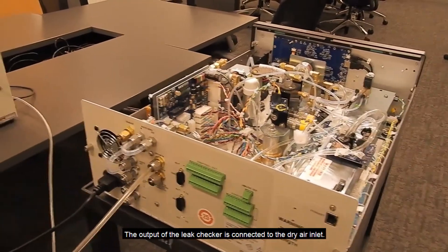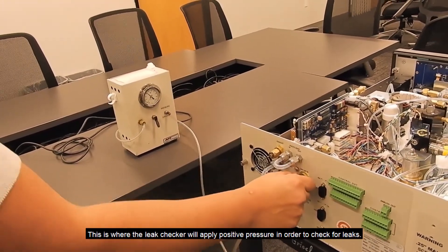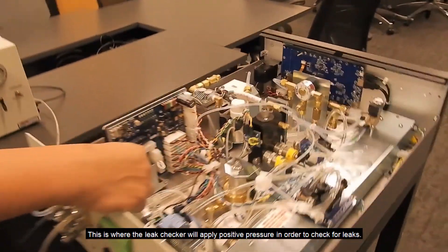The output of the leak checker is connected to the dry air inlet. This is where the leak checker will apply positive pressure in order to check for leaks.